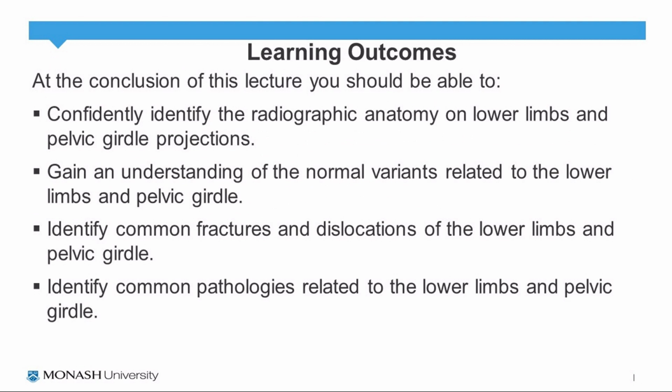So at the conclusion of this lecture, and specific to Part A, I hope you'll be confident in identifying also the radiographic anatomy, the normal variants, as well as common fractures and dislocations and common pathologies that are related to the lower limb and the pelvis.